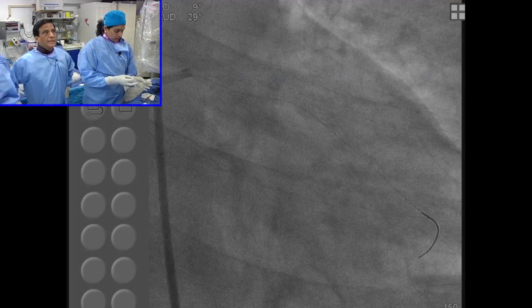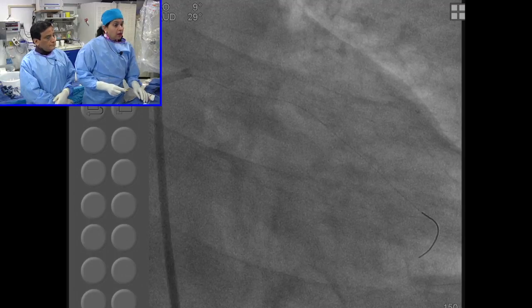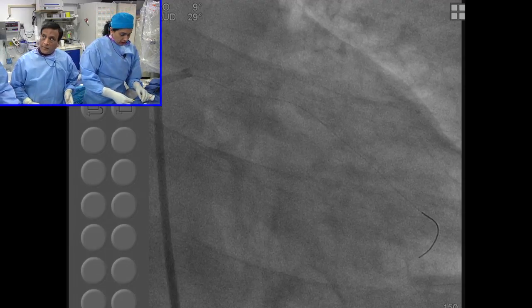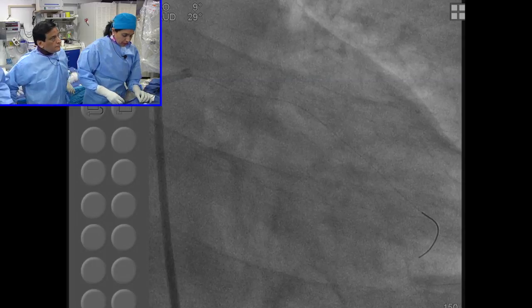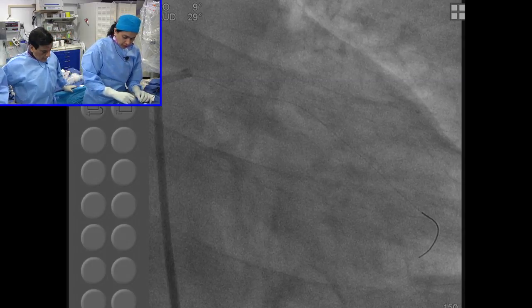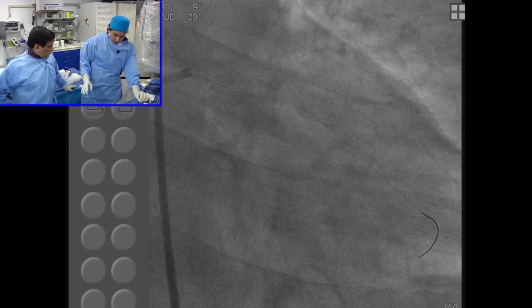Right. Anu, I'm sure your plan is going to be doing the distal lesion in the second OM first. Yeah, I think the distal lesion of OM1, we treat that. Yeah, right. Then the discussion will be how we take care of the bifurcation. Excellent. Wiring wise, same. You always take any 2. I mean, usually the side branch.